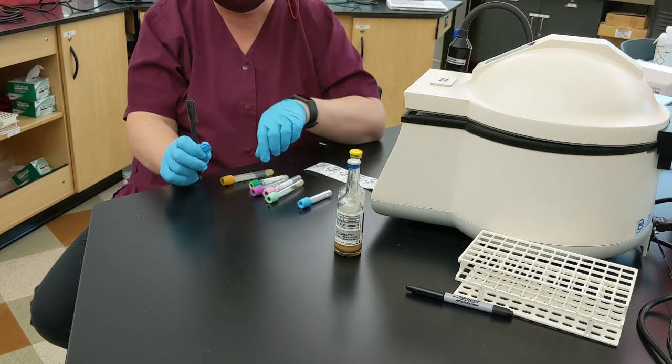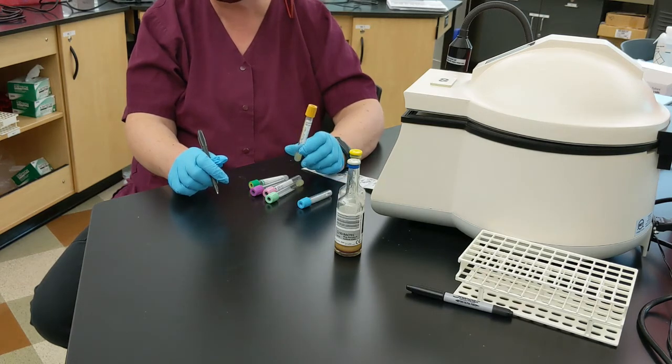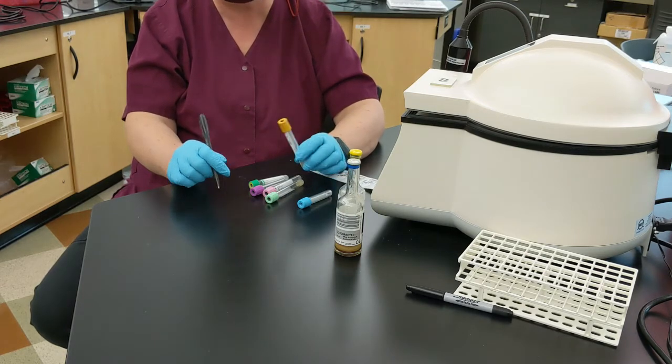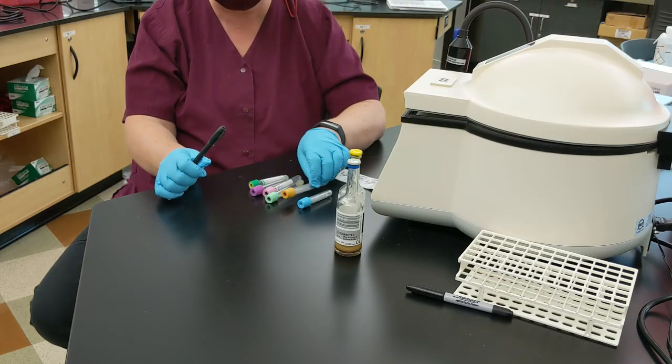Then you're going to do tubes that don't have any additives. So gold — this is a serum separator tube — would go second. Or it could be a tiger top. There are other tubes that do not have anything in them; it could be gold or tiger top.